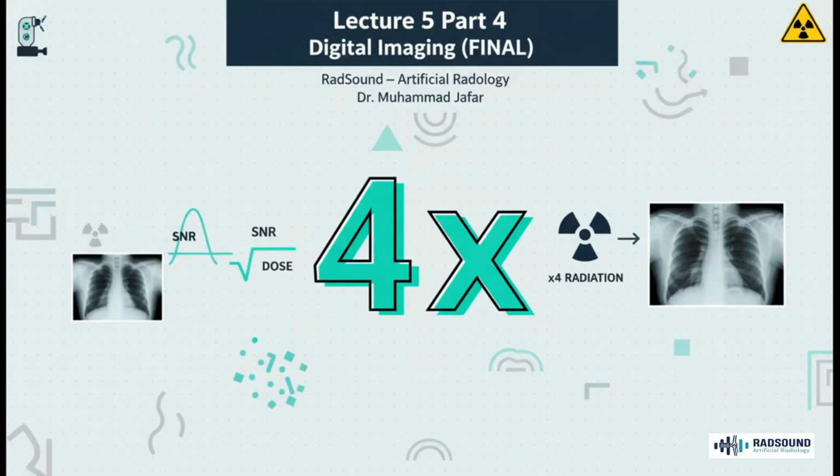Okay, if you only remember one thing from this entire discussion, make it this. Because your SNR is tied to the square root of the dose, if you want to double your image quality, to double your SNR, you have to quadruple the radiation dose. Just let that sink in. It is not a one-to-one deal. Improving image clarity is incredibly expensive when it comes to patient dose.